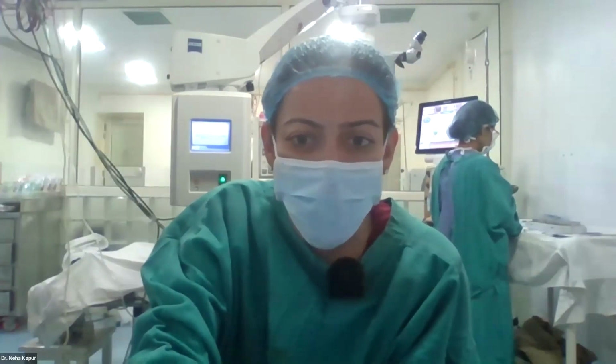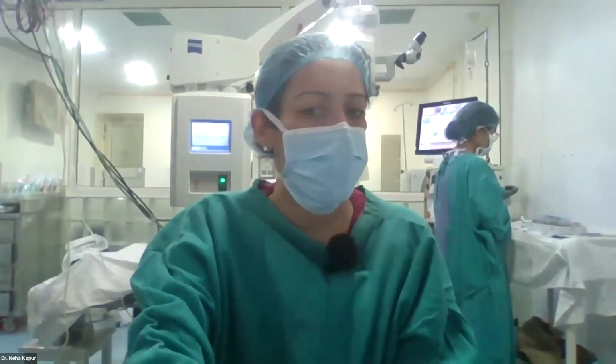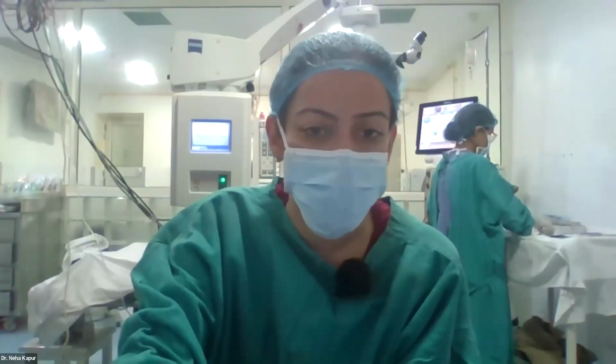Is there any conjunctival complications? As here, bleeding occurred during the procedure. This is usually a very small amount. This is almost negligible. So no complication.